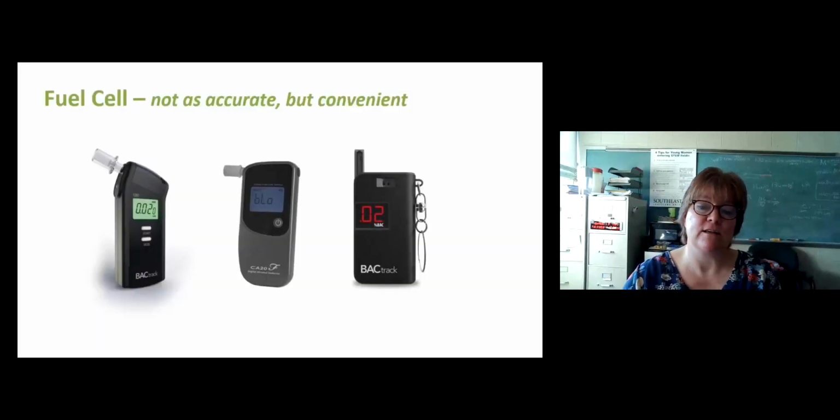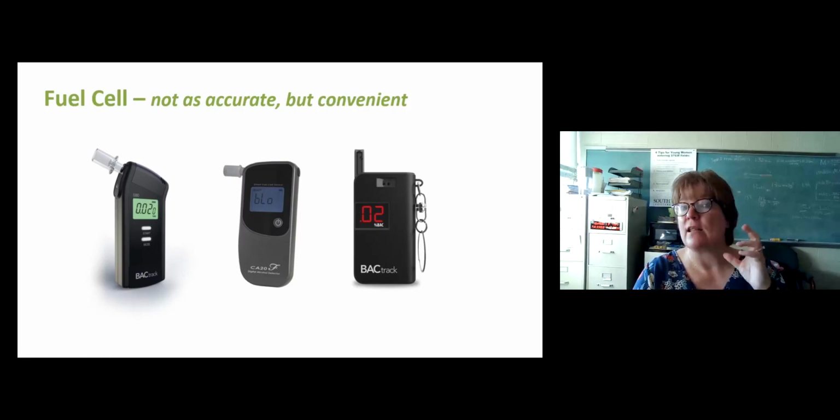So these fuel cells, this is what the units we tend to see look like. These are various different ones, but you blow into them and it can do a readout. It's doing an electrochemistry test using electricity.